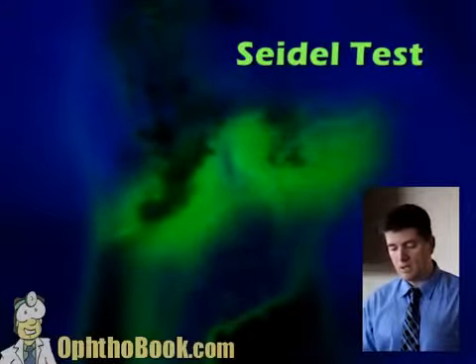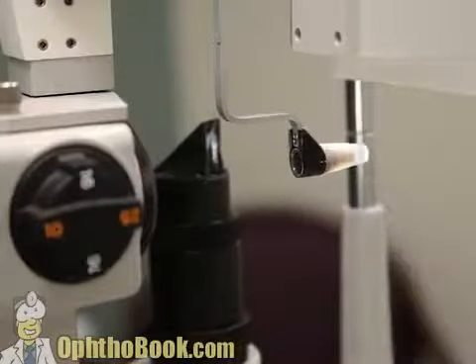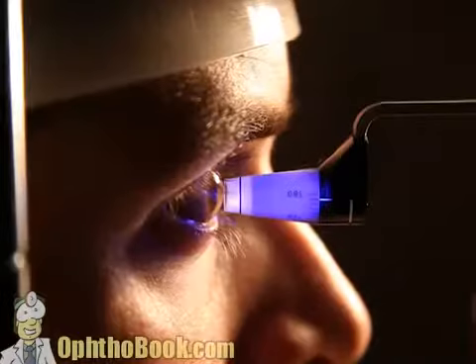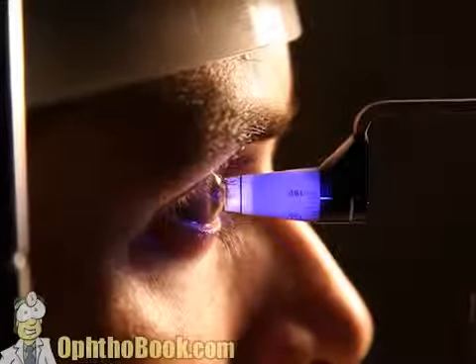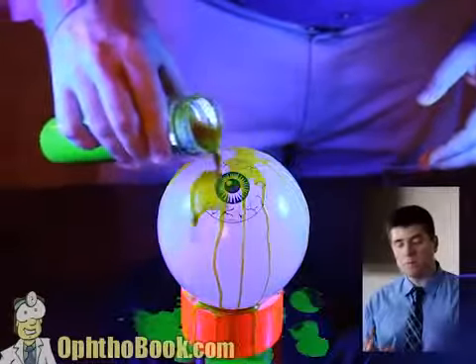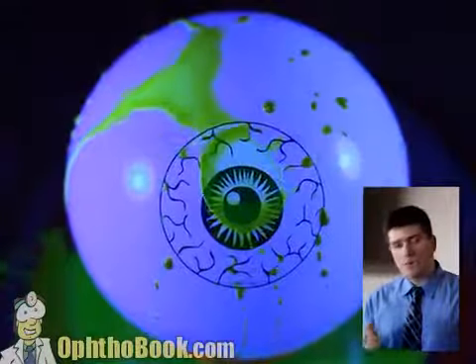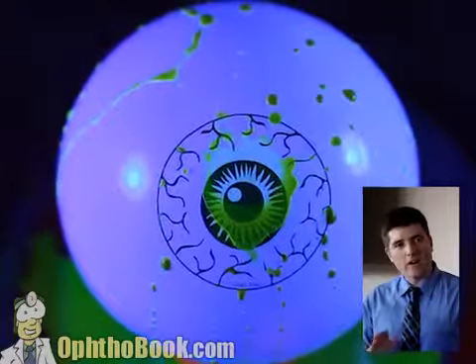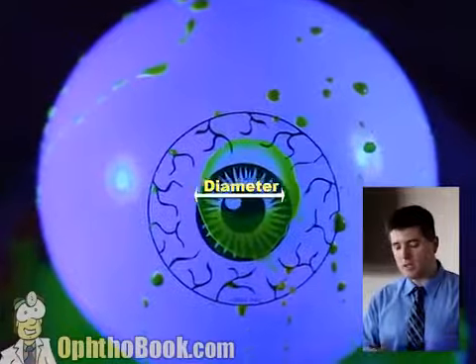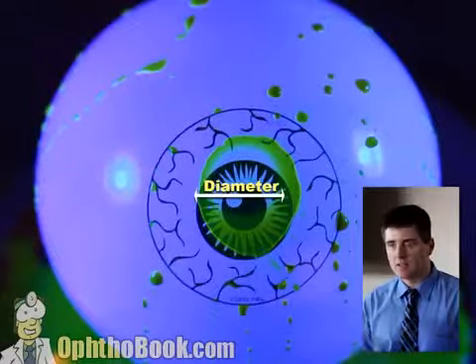infection. The use that we use the blue filter, though, the most, of course, is when we do applanation tonometry, which is when we light up our blue applanation tip, we push it on the surface of the eye in order to estimate the internal ocular pressure. And the way it works is if you have a thin-walled sphere and you push on it with a certain amount of force, the amount of force you use and the area that becomes flattened, which we can measure by looking at our fluorescein mires here, can be used to calculate the internal pressure inside that sphere.